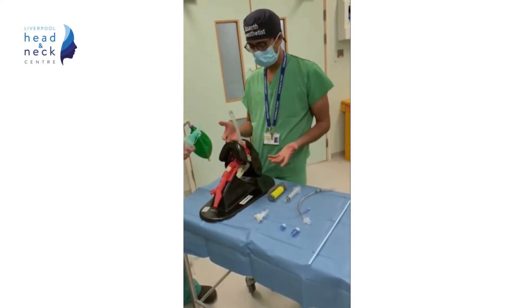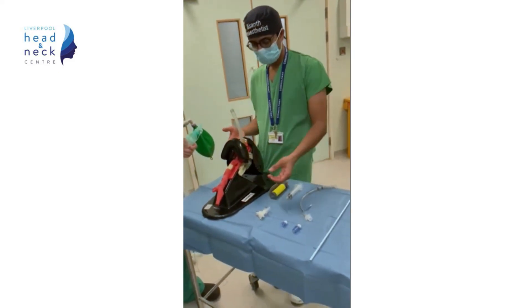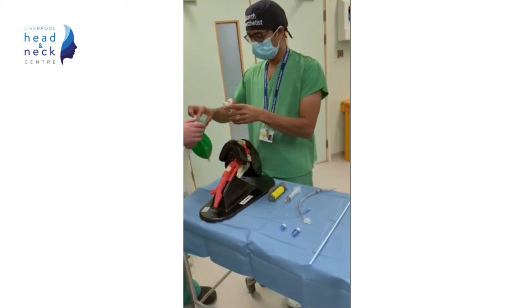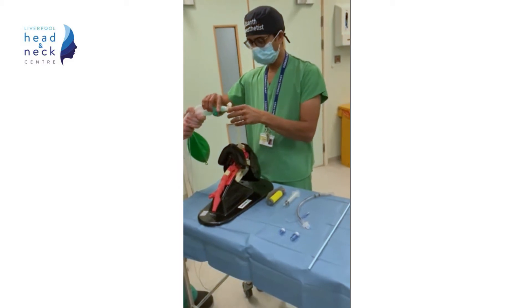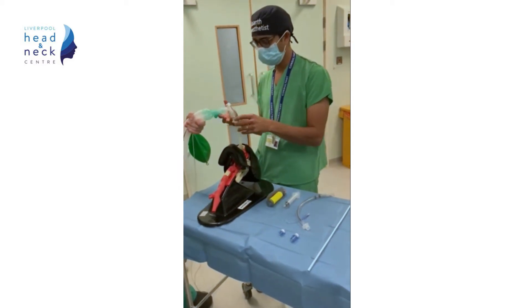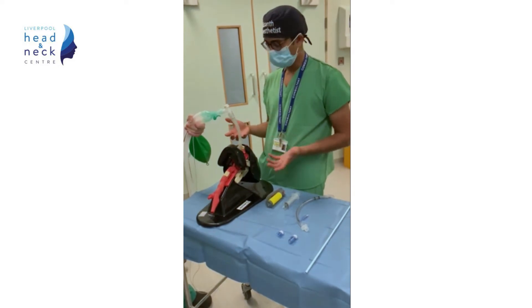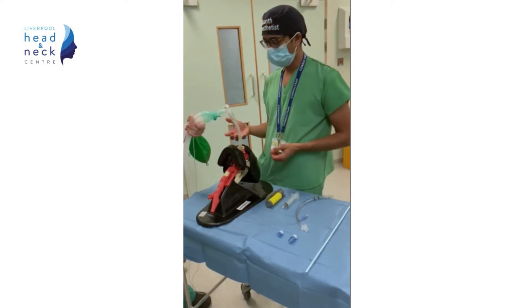The patient is a difficult intubation and an LMA has been inserted. The patient has been adequately oxygenated and ventilated. We now have to convert to an endotracheal tube using the Aintree intubation catheter. The first thing to do is to attach the swivel connector and access port and connect to the anaesthetic circuit, and continue to oxygenate and ventilate your patient.